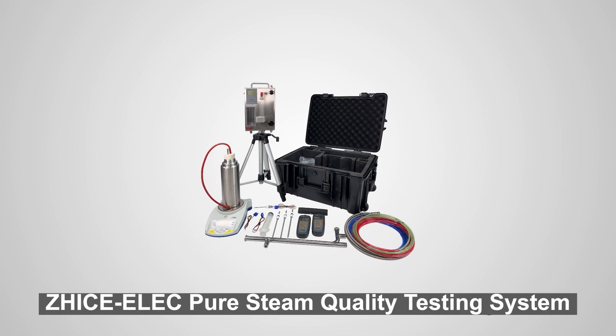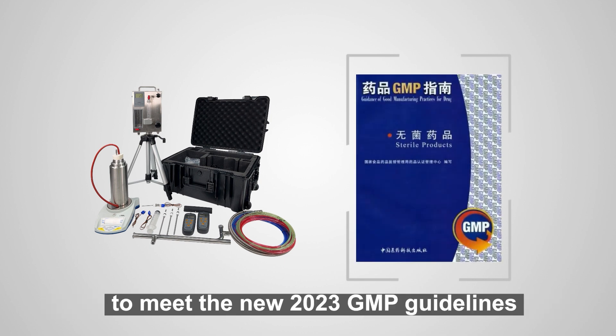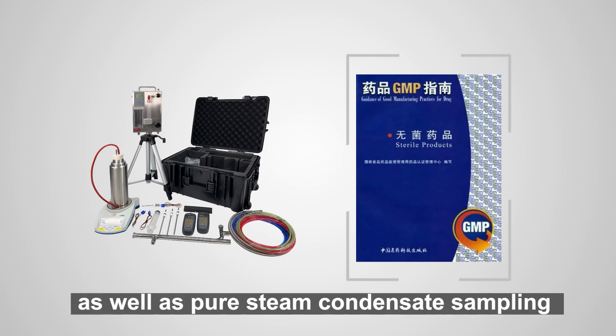ZHICE-ELEC Pure Steam Quality Testing System adopts the HTM2031 and ISO EN285 standards to meet the new 2023 GMP guidelines, and provides reliable and effective testing for non-condensable gases, superheat and dryness values, as well as pure steam condensate sampling.